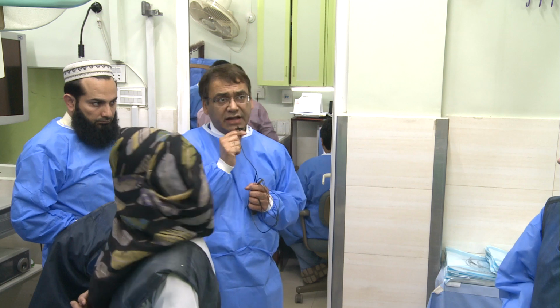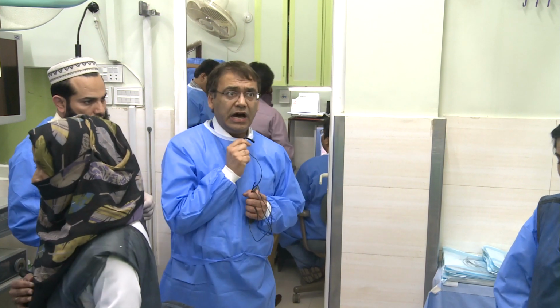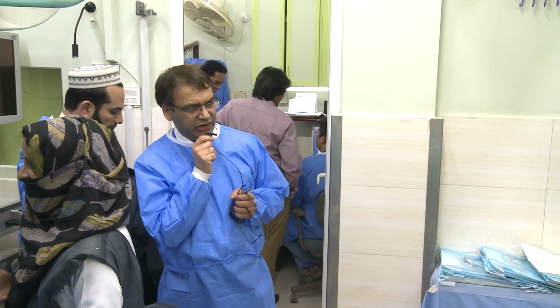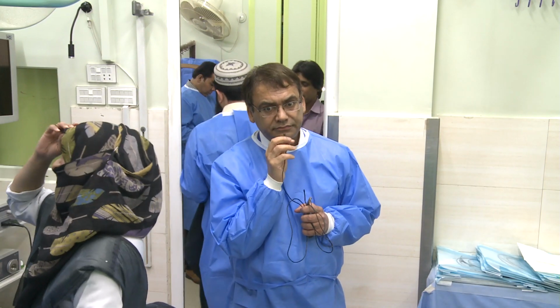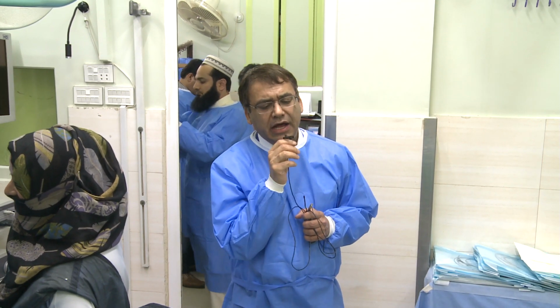These SOD type 2 patients require a sphincterotomy. But again, as I said, if you do a manometry and you're able to document it, at least you have a definite diagnosis. Yeah, but you're going to cut anyway, so it doesn't really matter. So we just don't bother with it. We go by clinical diagnosis.